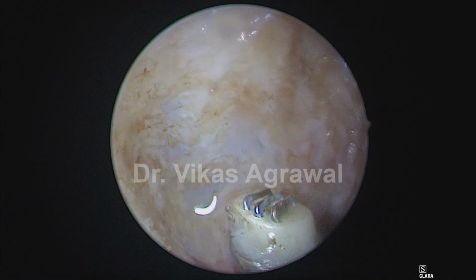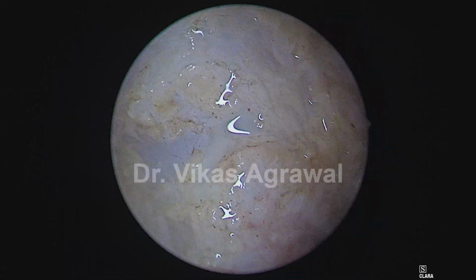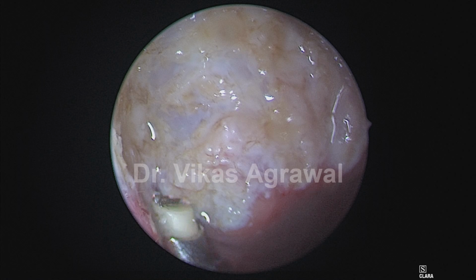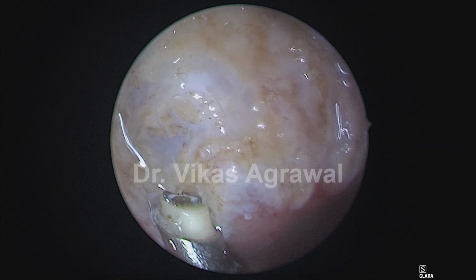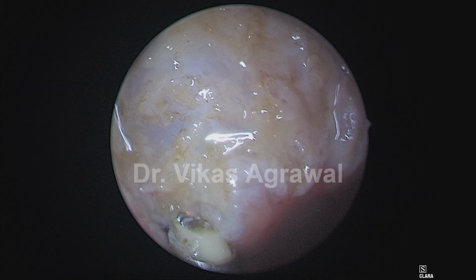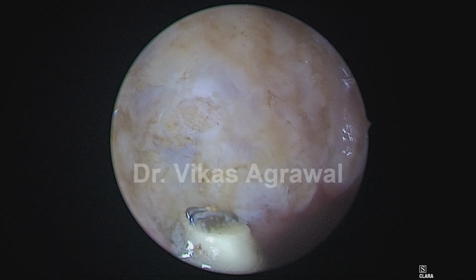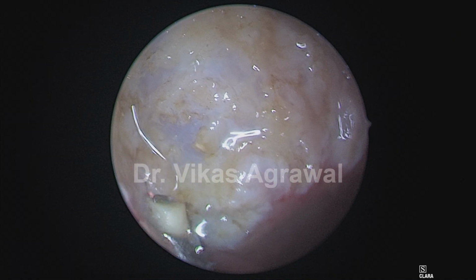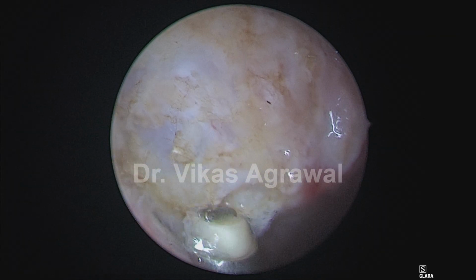Alright, now we come to the inferior boundary, which is the Passavant's ridge. So obviously this area, once you go near the muscles, you will see a twitch. The muscle will be horizontal. So you'll see a horizontal twitch. So far there is no twitch. So I know that I am away from the muscle. Obviously muscle will come only after the fascia. So unless you go very near to the fascia, you will not see the twitch.